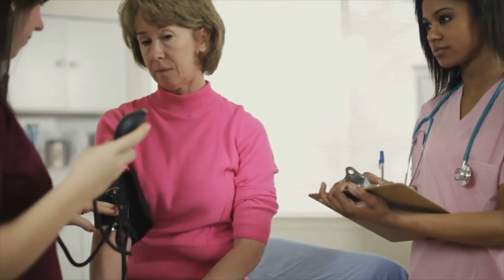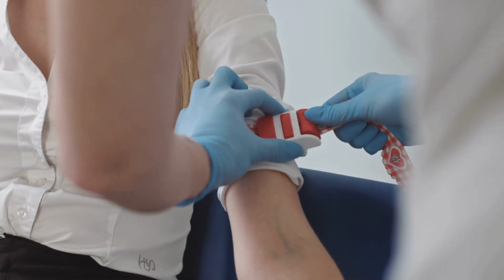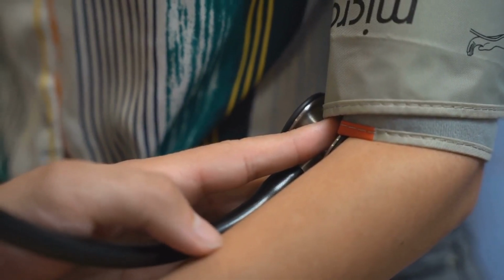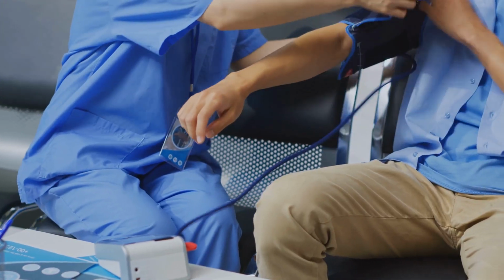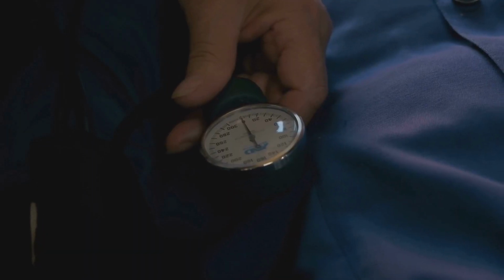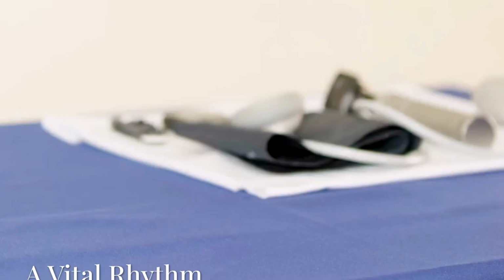To measure blood pressure, use a sphygmomanometer and a stethoscope. Wrap the cuff around the upper arm, slightly above the elbow. Place the stethoscope's diaphragm over the brachial artery. Inflate the cuff until the pulse disappears. Slowly release the pressure while listening for the first Korotkoff sound, which indicates systolic pressure. Continue deflating until the sound disappears. This marks the diastolic pressure.